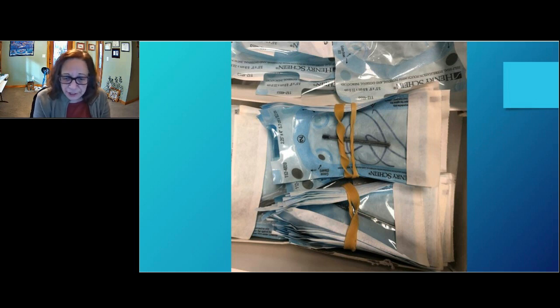Alternatively, which I actually think is a much better idea, is just get small plastic bins, something that can be cleaned with a disinfectant, and put whatever you're trying to keep together, that set, into that small bin. It could be plastic, it could be metal, whatever works for you. If it's a metal bin, the advantage could be, if the instructions for use are consistent with that, you could potentially put that bin in your ultrasonic periodically, and you don't have to manually clean the bin yourself.